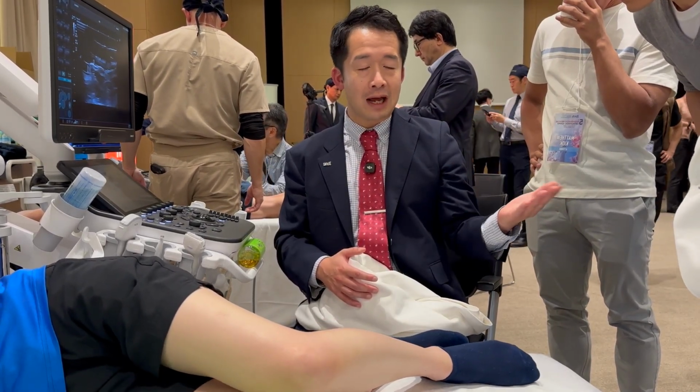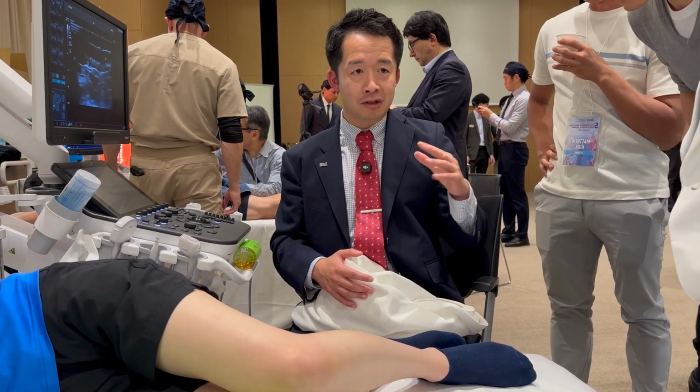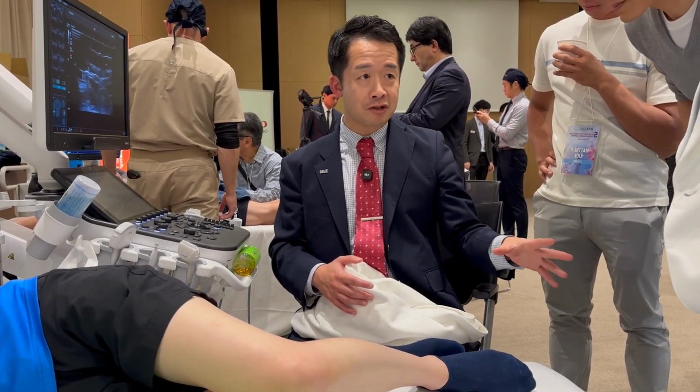What I will start with is first visualize that patella tendon and scan laterally. So that's how I would do it. I will do the basics first, and then as time allows, I will start scanning other more advanced structures, if that's okay.